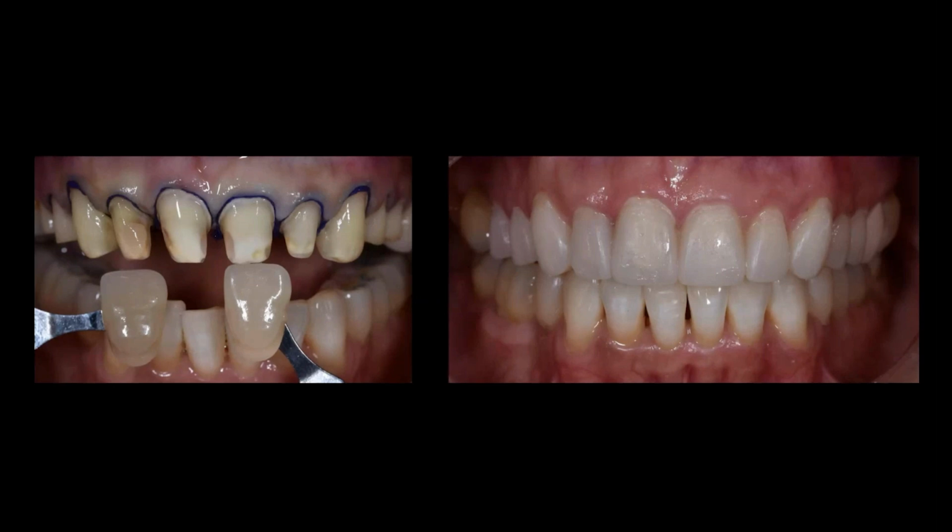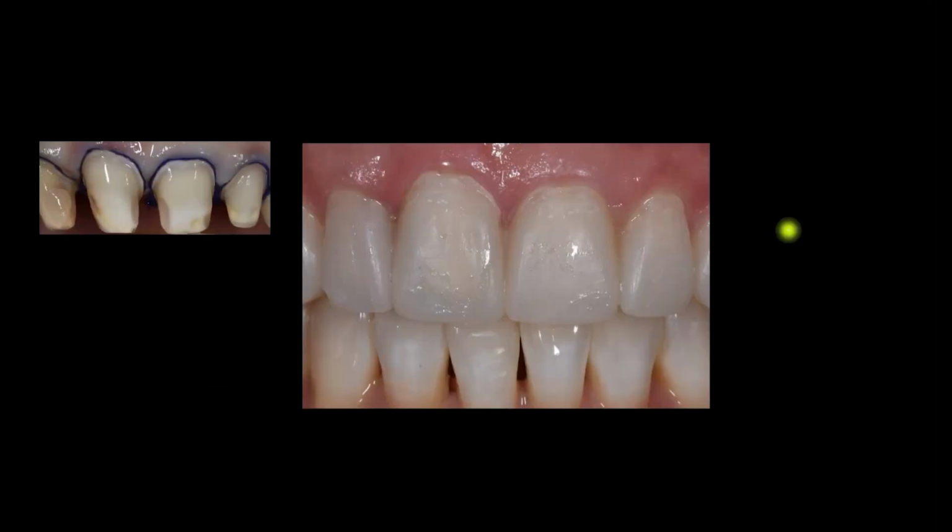We did try to stay as minimally invasive as possible. So you can see Dr. Dane's preps here were really, really minimal. Obviously, there's still a lot of composite on the teeth and some other things. But it was so minimal that if you look at the provisional, you actually can see the outline of the prep in the provisionals, right? So that's a sign for us that restorative options are very limited in the sense that we don't have a lot of room to work in, or we're going to have to prep these teeth more, and we don't really want to do that.